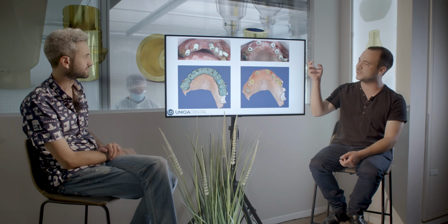Here we can see that eventually, with the implant-level impression that was taken, we chose to go with a straight multi-unit to avoid the buccal bulge. And in the design of the final restoration, you can see that with the straight multi-unit with a smaller sleeve, the screw channel goes buccally and distally to T225, and the screw channel is invisible, so it's a great option here to use the straight one.